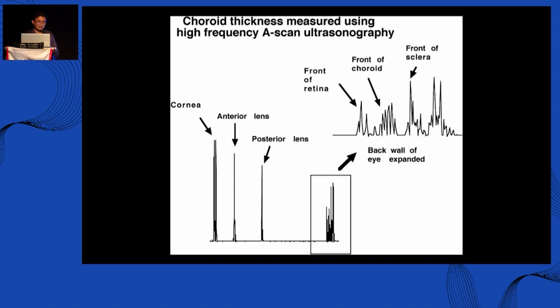So again, now we are going along A scan. A scan is important, as I said. When the spikes are perpendicular, then you know you are doing it properly. You have to focus directly on the fovea. So after some time, you gain confidence that you are aiming the scan probe at the proper place, so that you get all the axes correct.